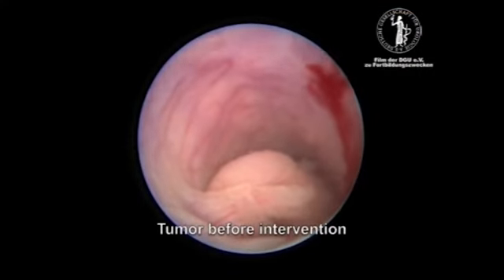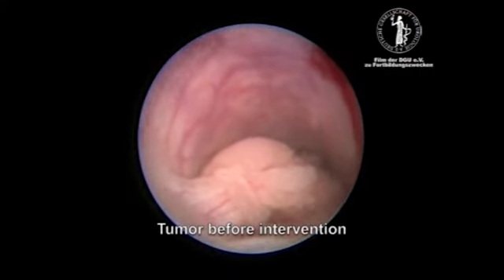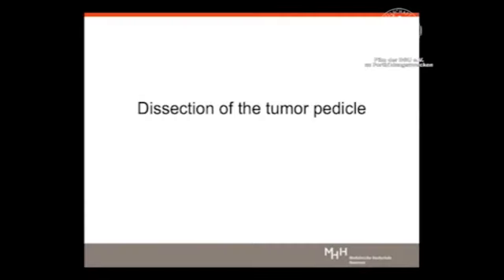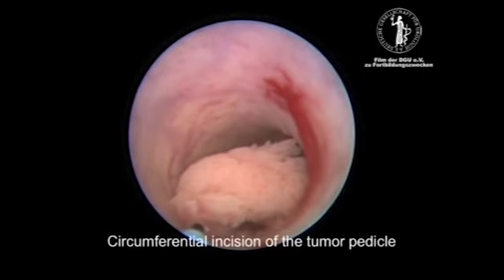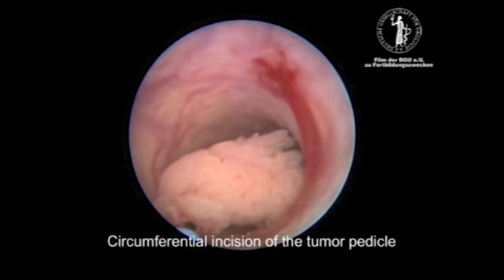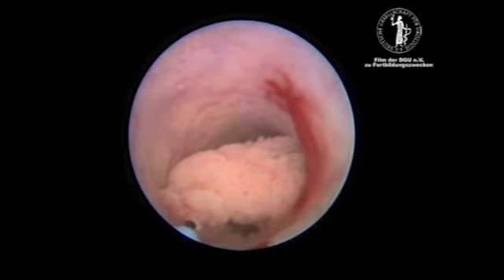This sequence shows the tumor before intervention. Dissection of the tumor pedicle. The tumor pedicle is circumferentially incised.